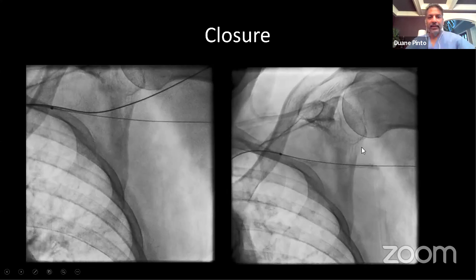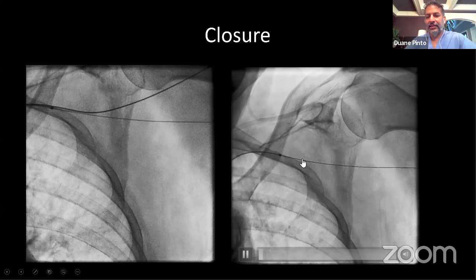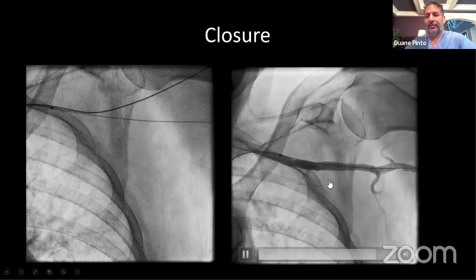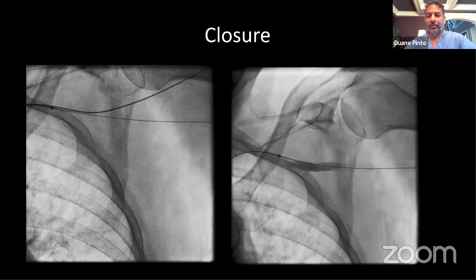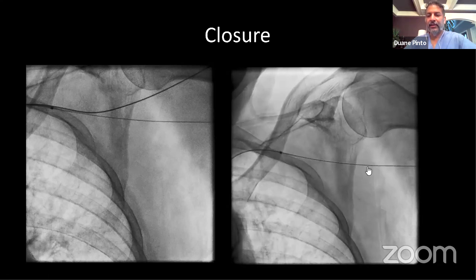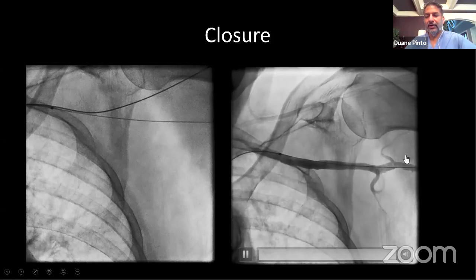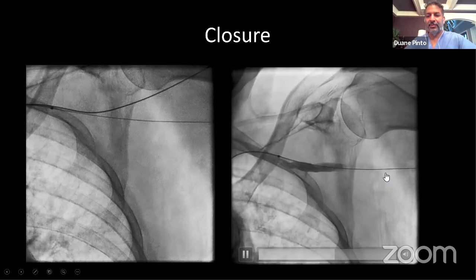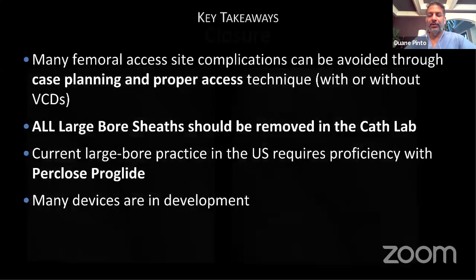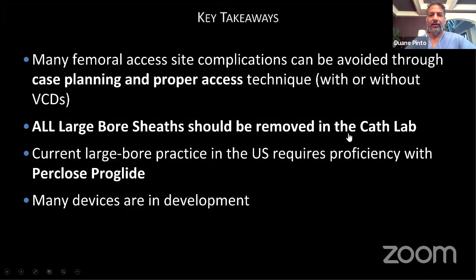Here's closure. Again, you see bleeding at the arteriotomy site, and this is after balloon tamponade, which we described earlier. It should be very infrequent, the need to place a covered stent in this area, though it is perfectly fine. You're away from the internal mammary artery, and you're also away from the other important branches if your stick has been correct. But again, if you rotate that picture 90 degrees, this is not unlike what you're used to looking at on the common femoral artery.